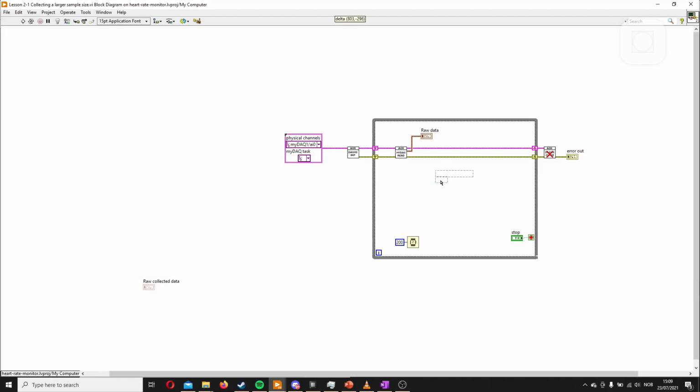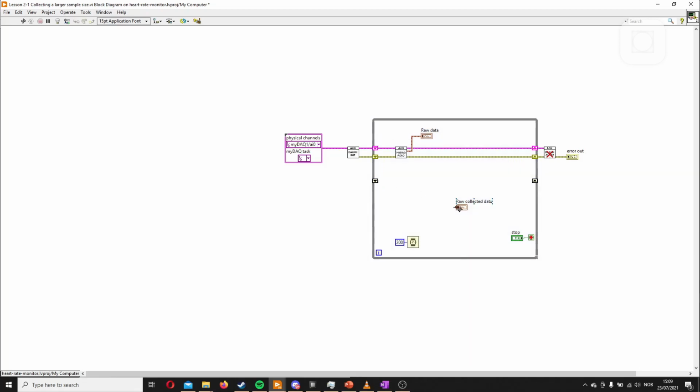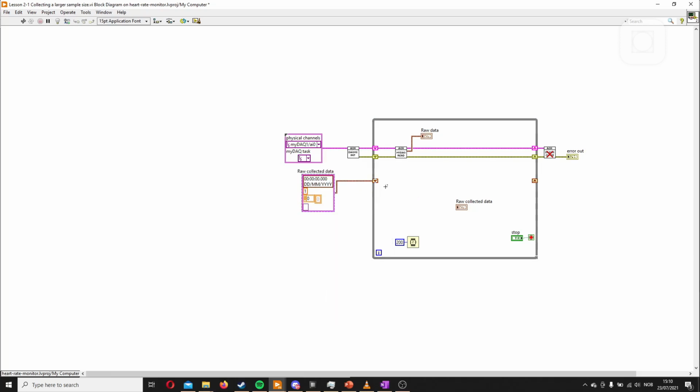So back at this one again, and here we have it. We need this data to go through some sort of transformation and then become larger. We have a shift register here for this one, but this is more of the input data. We want some data which is just stored in this loop. So we'll add a shift register to save data. We create a constant here, and we'll place this one outside as the input. You can call it visible label, raw collected. That's a good name.